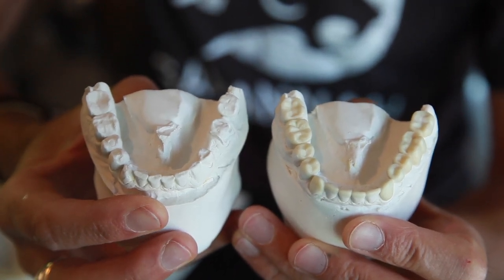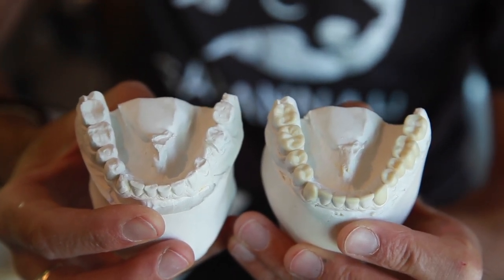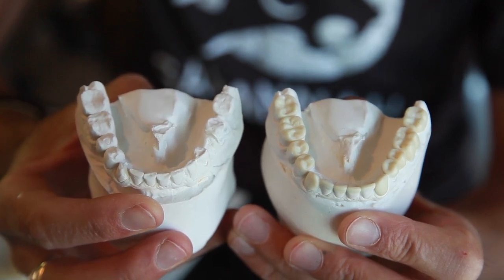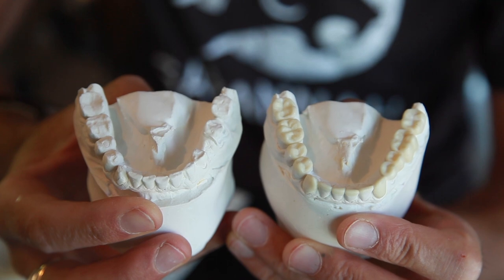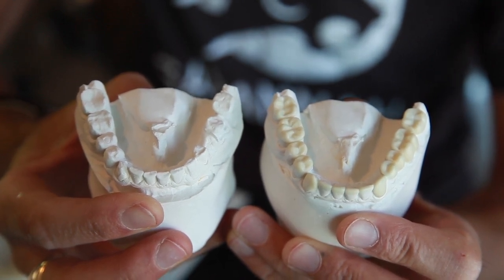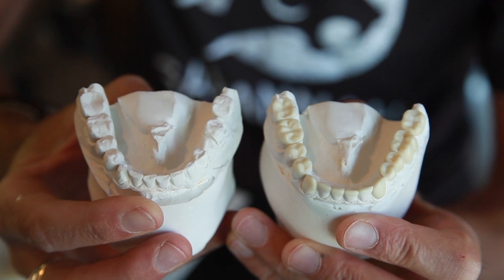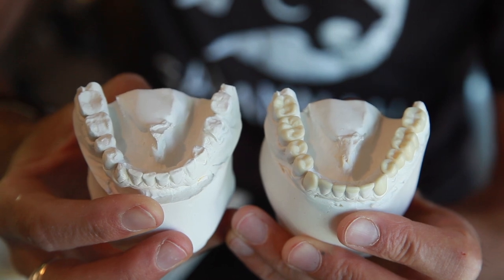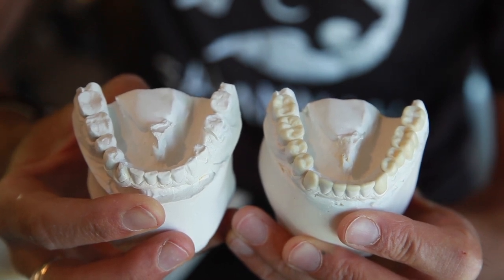We've completed the wax-up and you can see we've made some pretty big changes for this patient. Right now we're going to put some form back into the patient's mouth. This patient has an airway issue, so after this has been put in the mouth, the patient will go into a DNA appliance to widen his arch, give him more room, and help his airway.